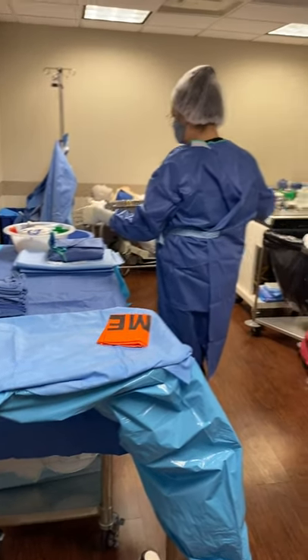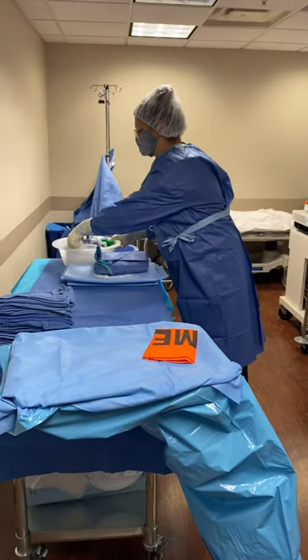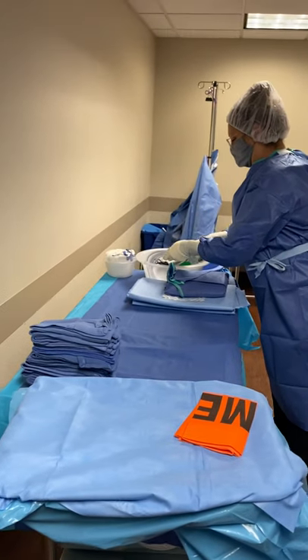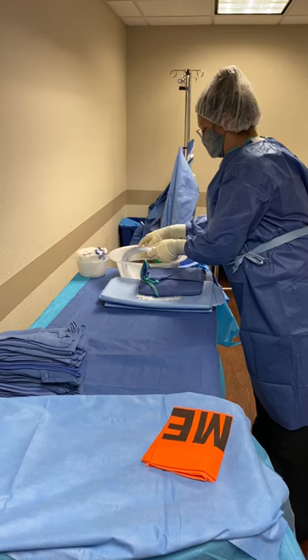This end is going to wheel up to the patient, so this is where I'm going to have my instruments. That's something that you'll want to keep in mind for yourself as we are making your table setup.